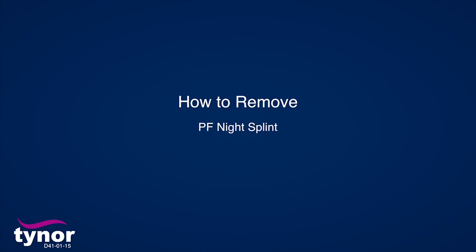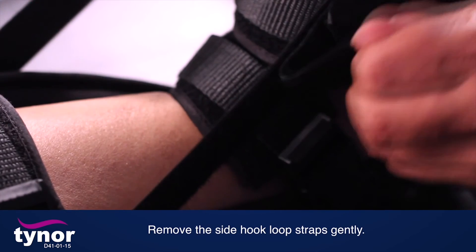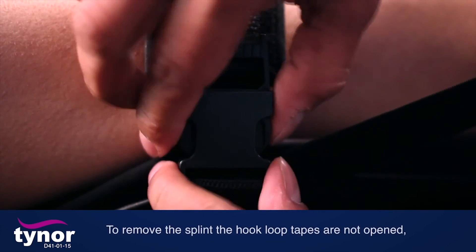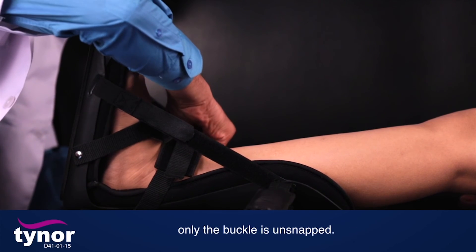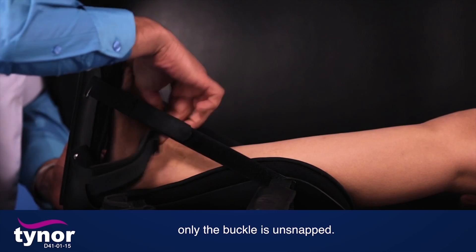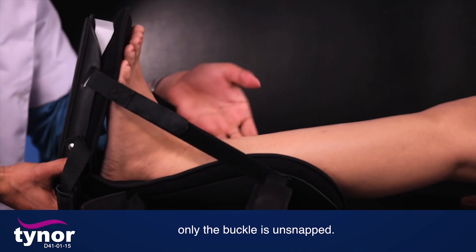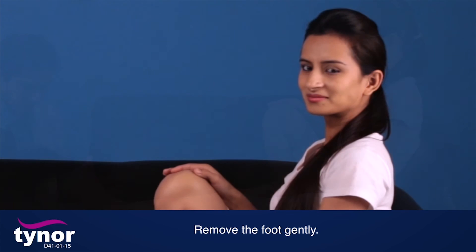How to remove the PF Night Splint: Remove the side hook-loop straps gently. To remove the splint, the hook-loop tapes are not opened — only the buckle is unsnapped. Then remove the foot gently.